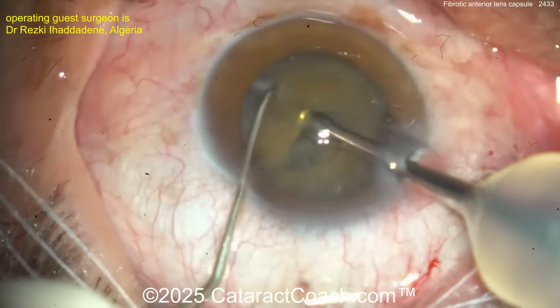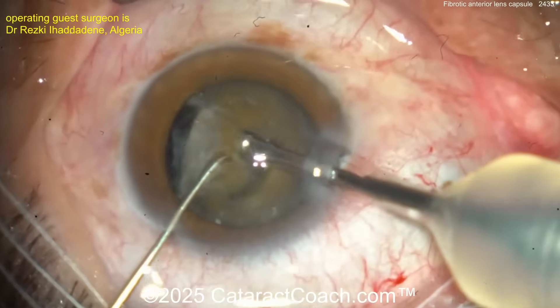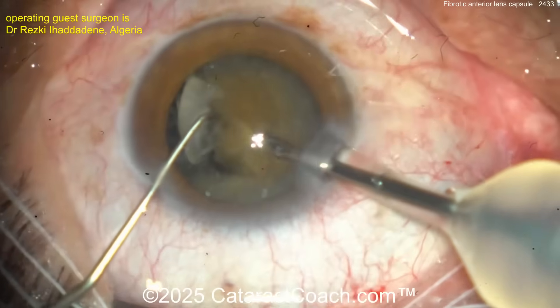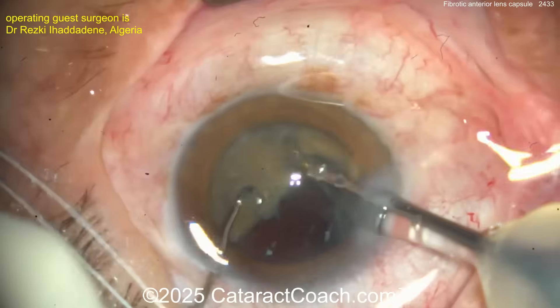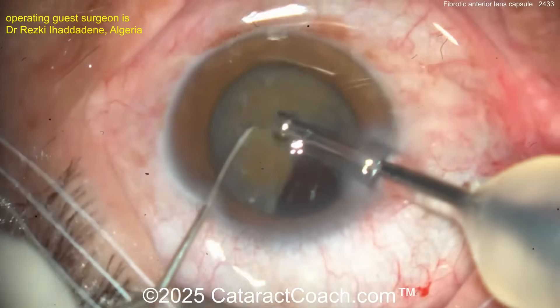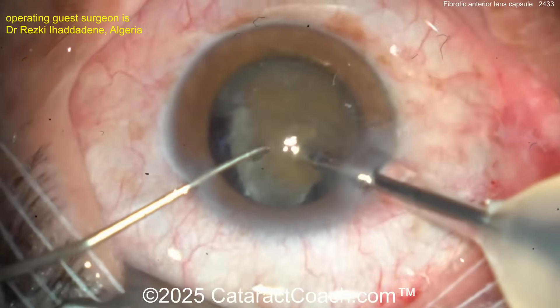Nice clean chops. I like how you use the wall of the groove to bury the phaco tip in the meat of the nucleus — that's really smart. If you're a student and didn't quite get that, go back and watch it again. Rotating again, the probe goes into the deeper, meatier part of the nucleus before the chop. Fantastic technique.